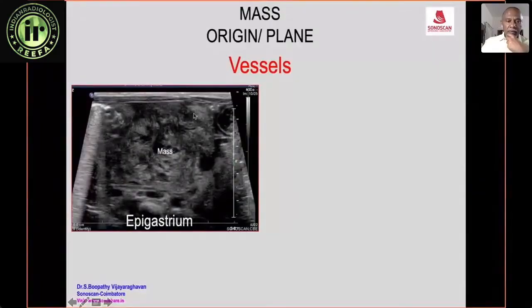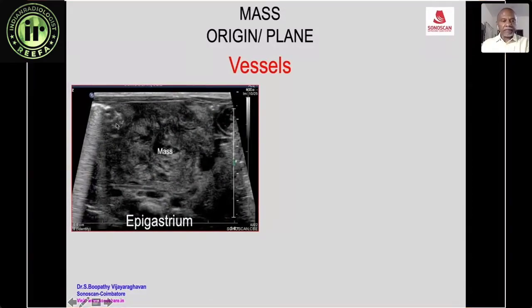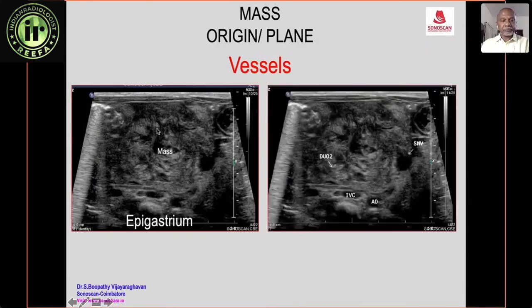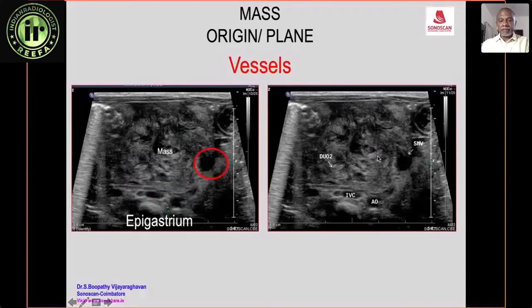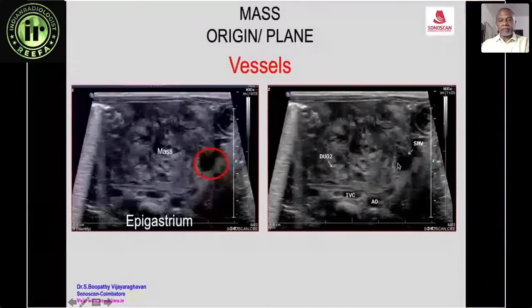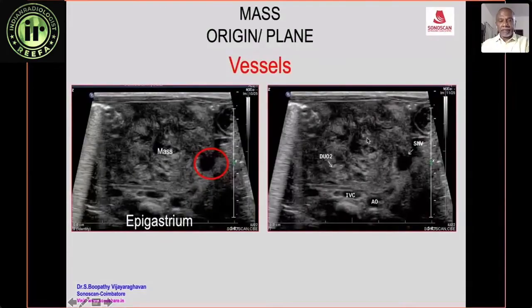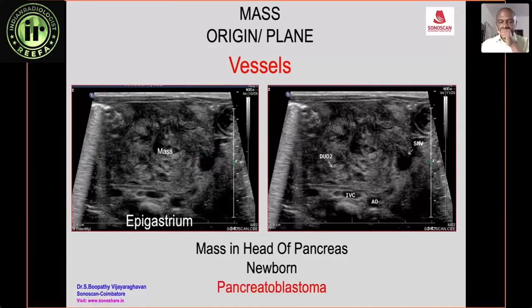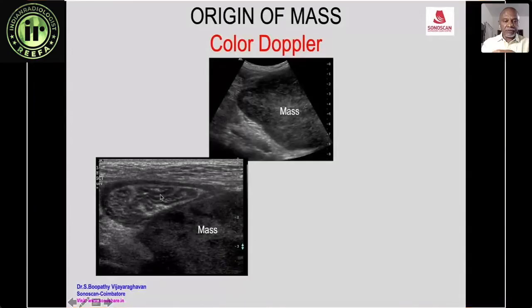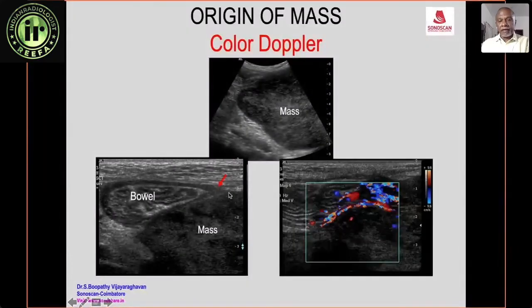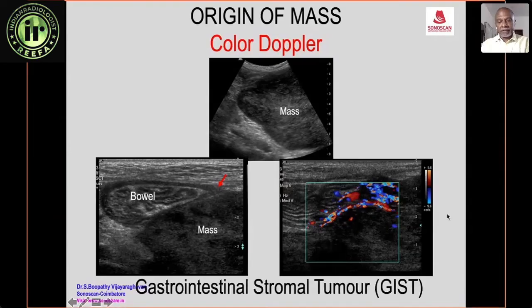A large right iliac fossa mass with external iliac vessels pushed anteriorly confirms a retroperitoneal mass, most likely lymph nodes. In a newborn with a large mass in the region of the pancreas, the duodenum is confirmed by fluid, the aorta and IVC are identified, and the mass lies surrounded by the duodenum, IVC, aorta, and superior mesenteric vein — placing it in the head of the pancreas. A heterogeneous mass in a newborn in this location is a pancreatic blastoma. Color Doppler flow from a small bowel loop confirms bowel origin for another mass.